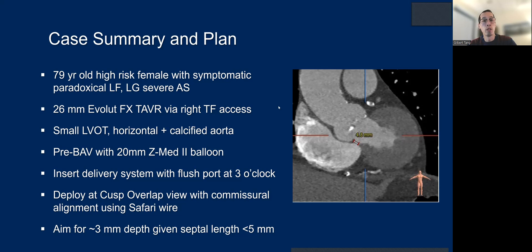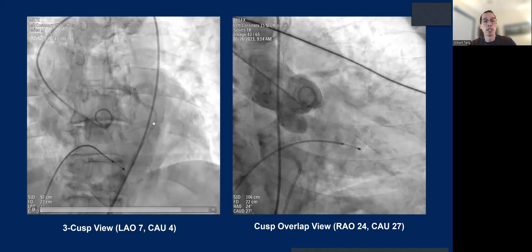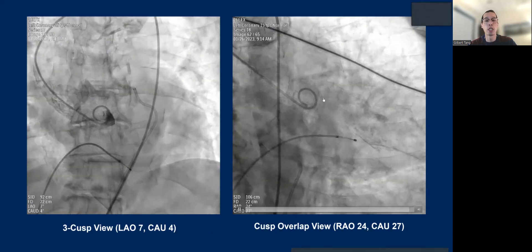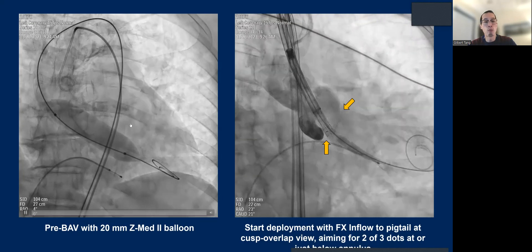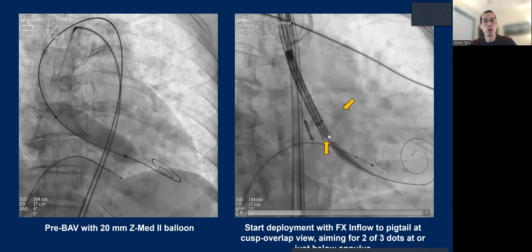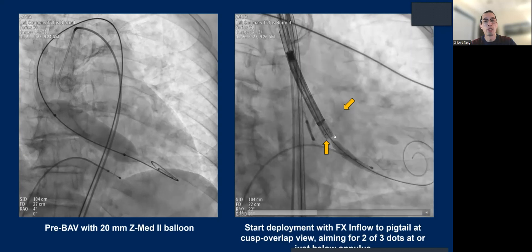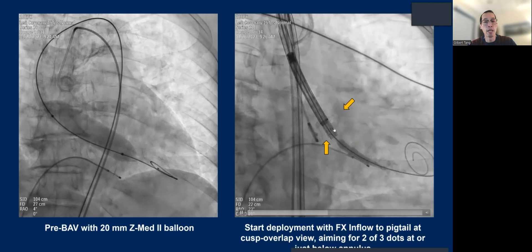We insert the flush port at 3 o'clock with the delivery system and deploy in a cusp-overlap view. We aim for implant depth around 3 millimeters given the septal length is less than 5. On the left is the free cusp view — you put the pigtail in the right cusp, swing the C-arm over to overlap right and left to generate the cusp-overlap view, very straightforward with minimal contrast. We deploy the valve inflow to pigtail at the base of the non-coronary cusp, as the Evolut FX system rarely dives significantly ventricularly — it's very stable at annular contact.